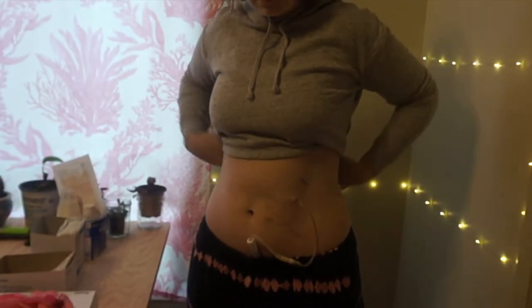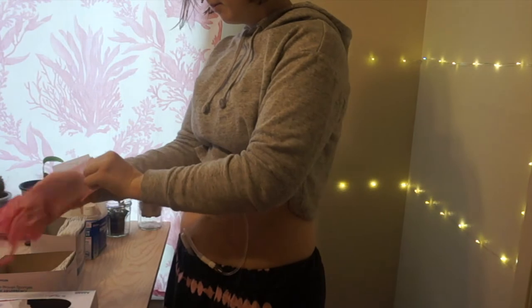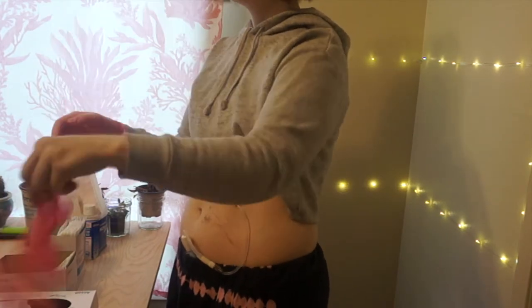Hello friends! Today I thought I would talk about how I take care of and secure my PD catheter. After my exit site became fully healed, I started showering every other day and changing my bandaging afterwards that I used to secure the catheter directly to my body.